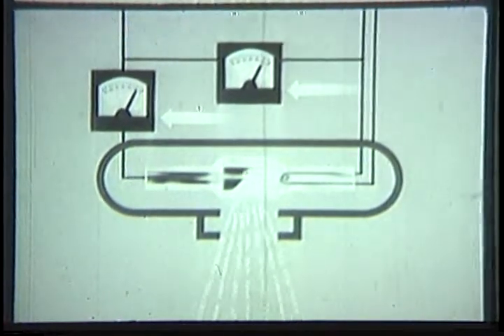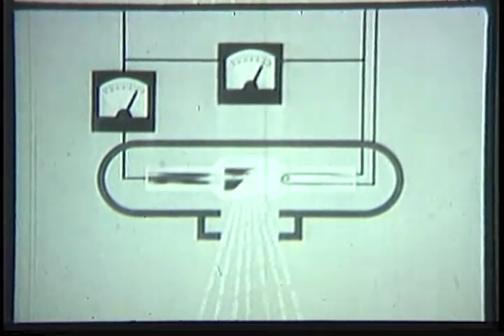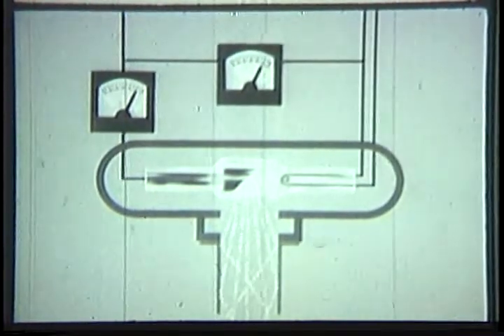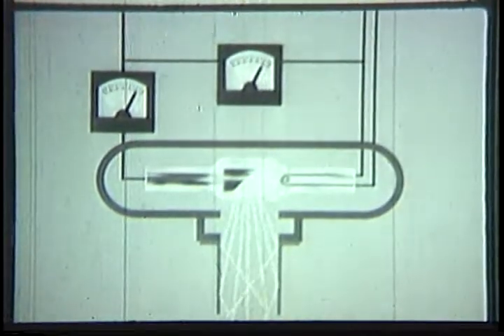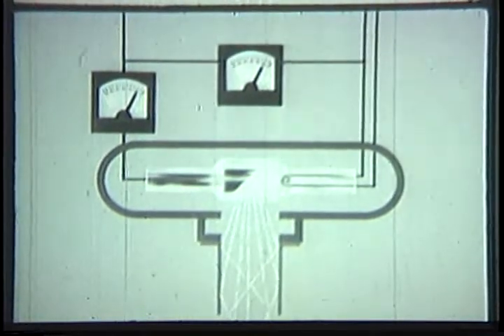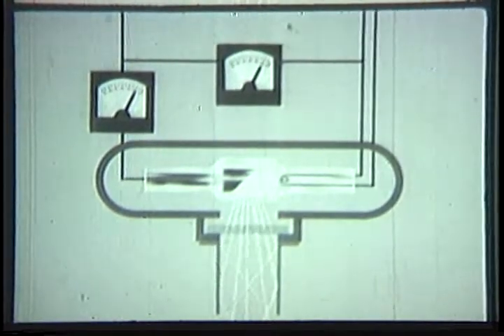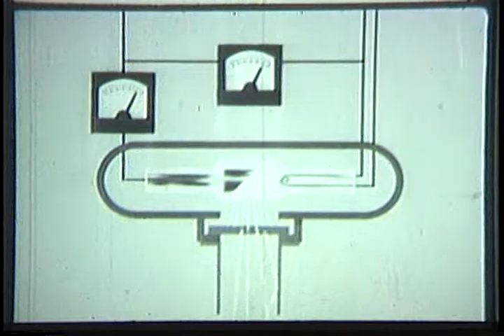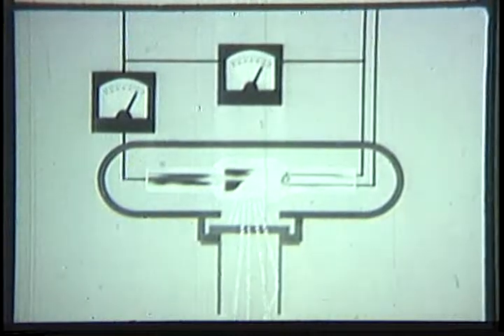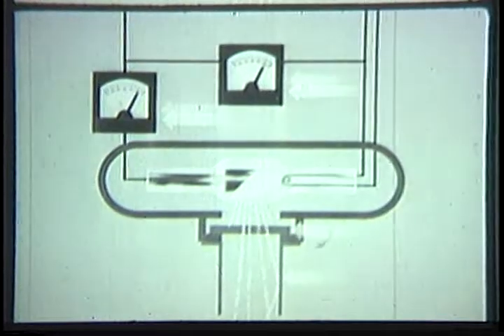For medical use, X-rays are applied to fairly small areas, so it's necessary to restrict the radiation. A lead cone, or a lead plate with a hole in it, may be used to reduce the scattering of the rays. In actual operation of an X-ray machine, different types of rays are produced. Since some of these rays are of a type that is not desired, they're screened out by means of filters. There are three factors, then, which affect the type and amount of X-rays leaving the cone: the voltage, the milliamperage, and the kind of filter used.